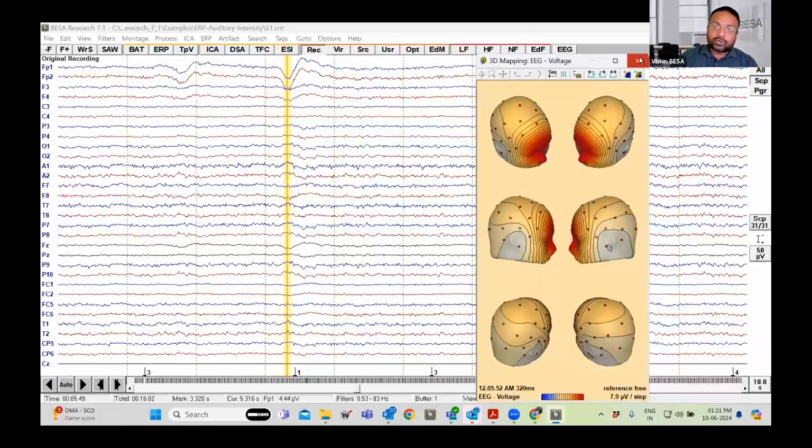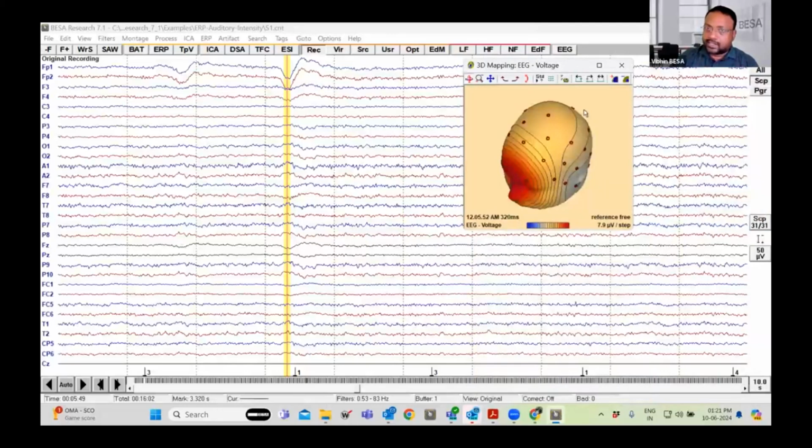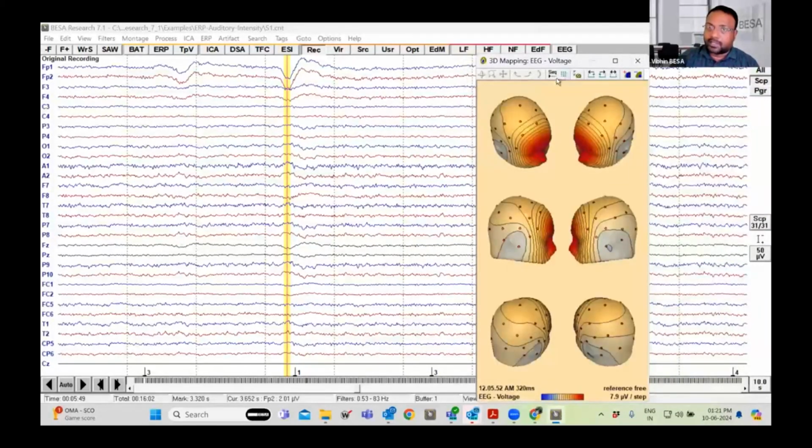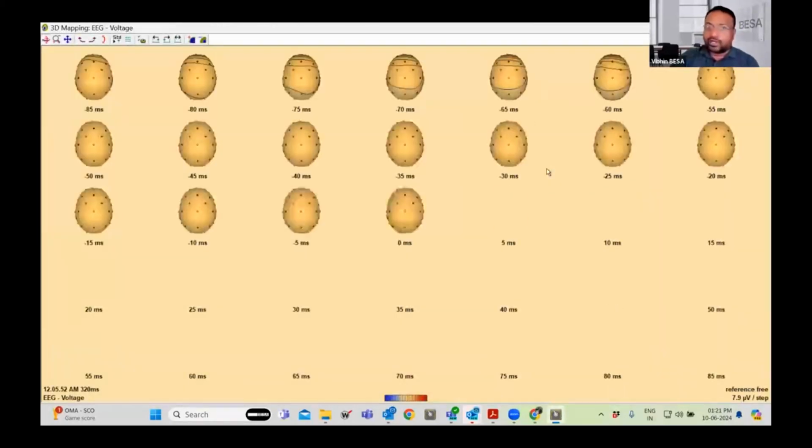Next, what I wanted to show you is in this page. This is the mapping region. You can double click on this and then you will get this one. Similarly, you can also use the standard view, during which you can see multiple ways of looking at the same data based on time.